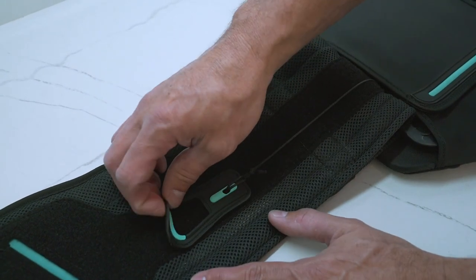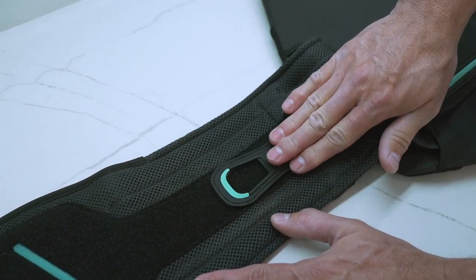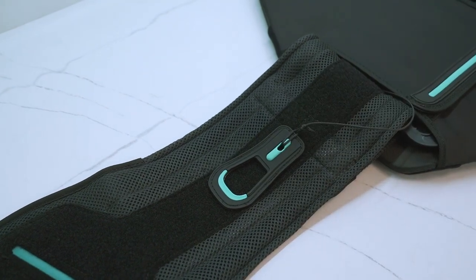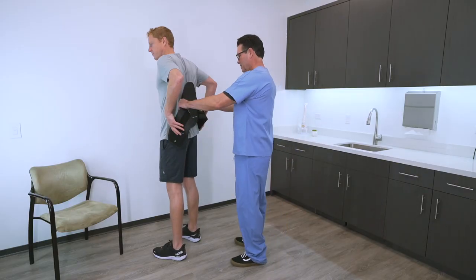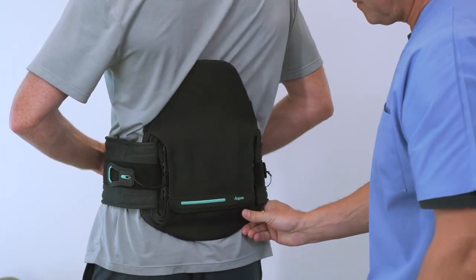To apply the Horizon Pro brace, first make sure the pull tabs are close to the back panel so that the brace can be fully extended. Next, center the back panel in the middle of the back as low as is comfortable.